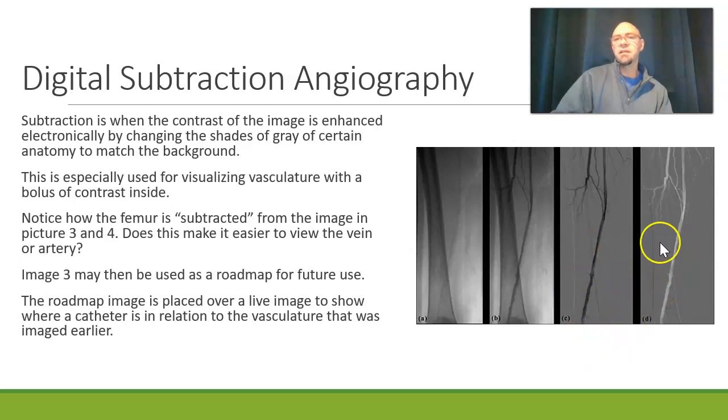And when you think about it, and I just caught myself when I was ending that last segment, this really here is more of what you would see, because don't forget, contrast is preventing X-ray from hitting the plate or hitting the image intensifier. And so when something does not hit the image intensifier, it's white or light gray.